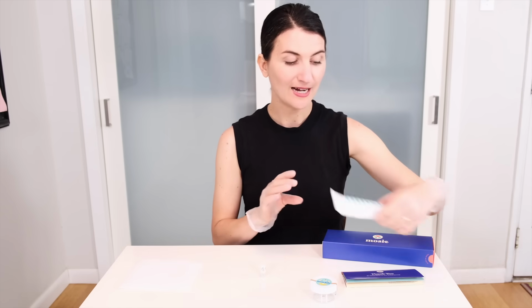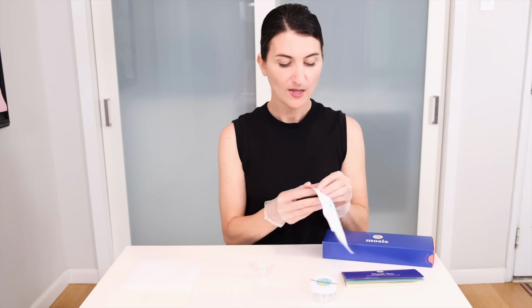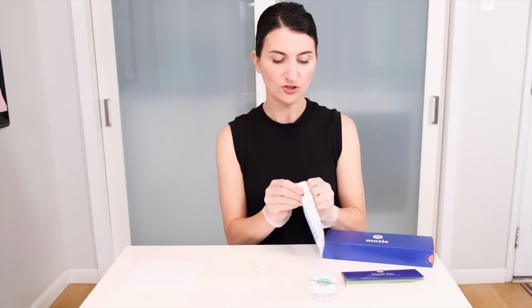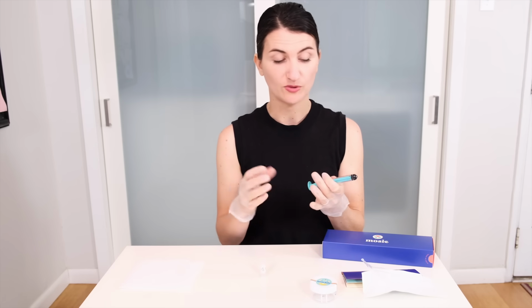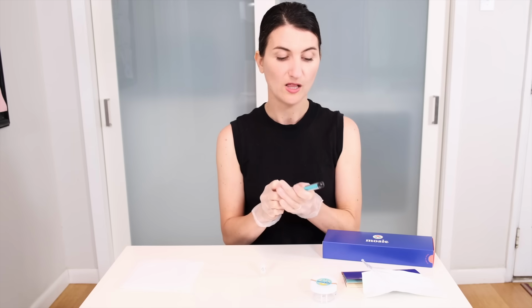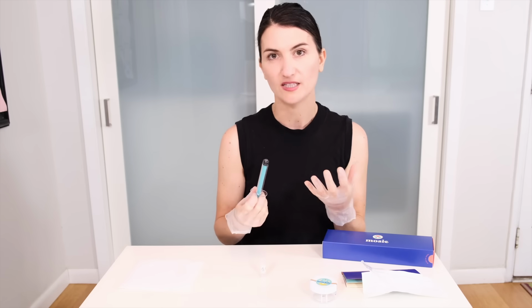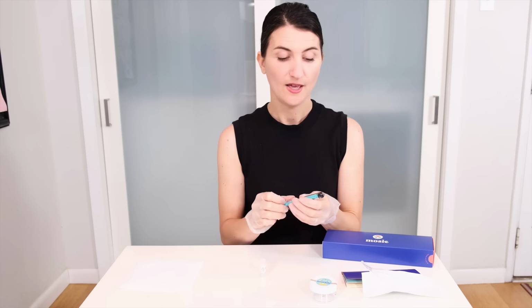Okay, so the next thing you want to do is get your syringe ready, and we are going to open up the Mosie syringe. And with any syringe, but we definitely recommend this with Mosie as part of our instructions as well, you pull it back and get comfortable with it. And know how it feels, just so you have the confidence for this process, that you're comfortable with the shape, the size, and the push and the pull.